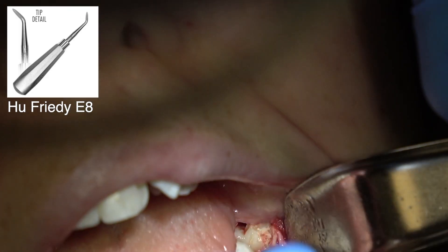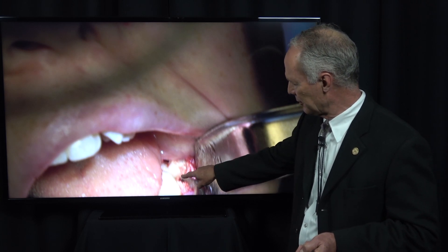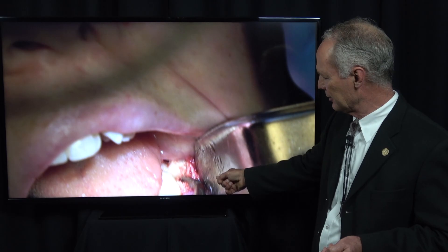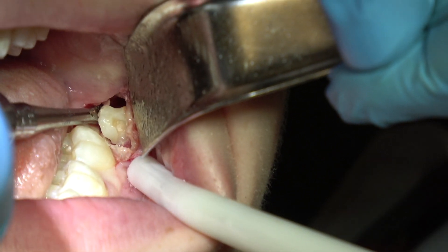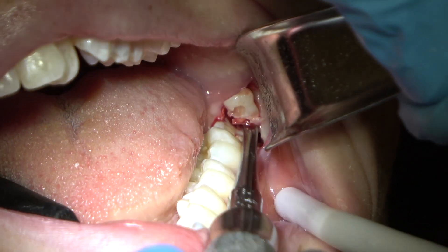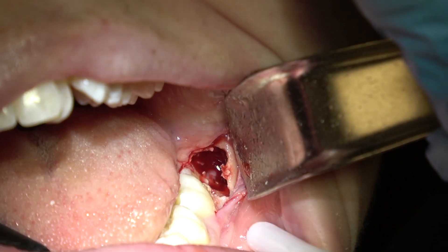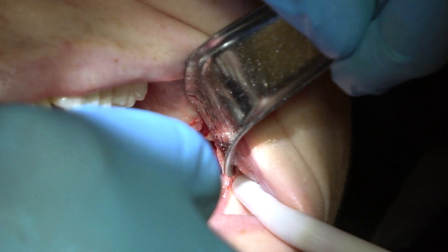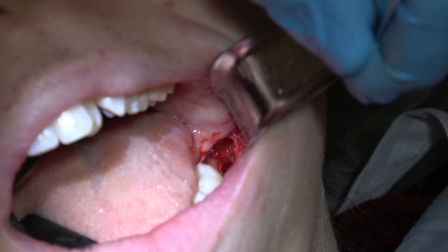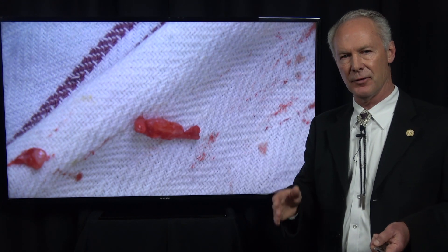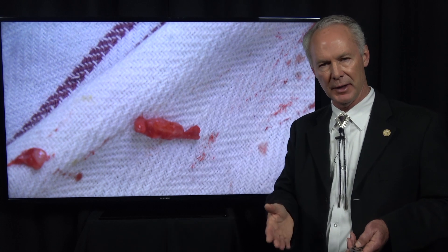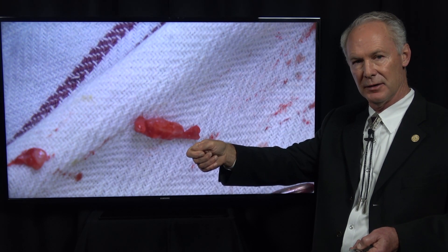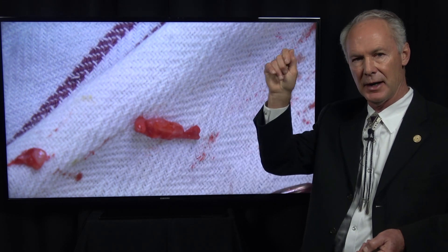I drilled a hole in the mesial part of the tooth and I'm using a pointed-tip elevator in that hole to elevate that piece. Now using the E301 to remove the other pieces. I'm going back to remove the follicular sac that was around the wisdom tooth. You want to remove this because a dentigerous cyst can form from a follicular sac, and an ameloblastoma can form from the dentigerous cyst. Don't curet it because there's a nerve down there — just remove it with your rongeurs and it'll peel right out. Then irrigate well.